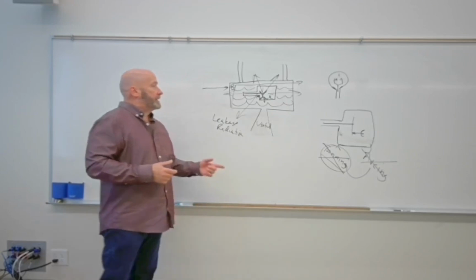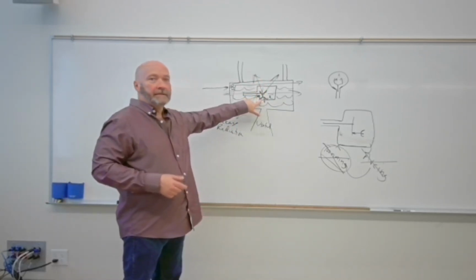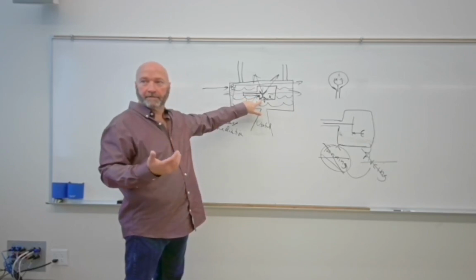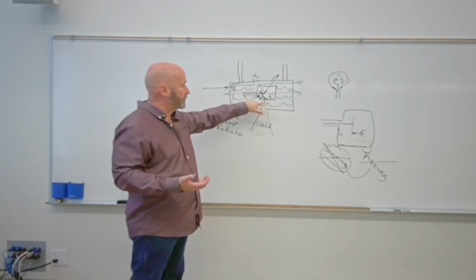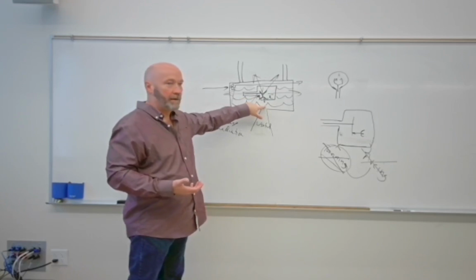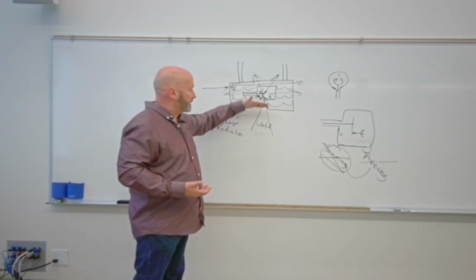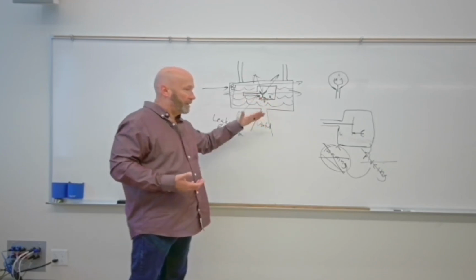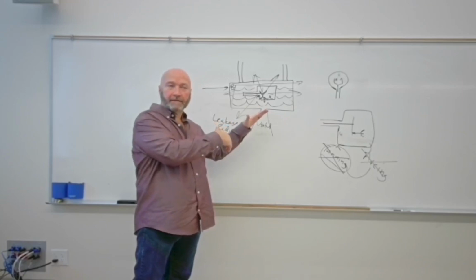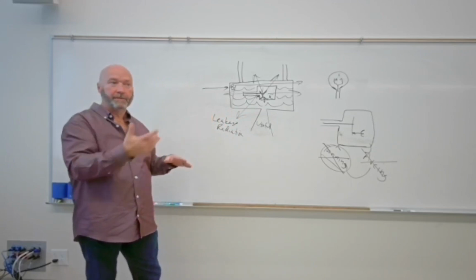What that means is that as the X-ray beam goes through the glass, remembering that nothing is radiolucent enough to absorb nothing, it's going to absorb some of those low energy X-ray photons. It's going to absorb some here in the oil. It's going to absorb some in this glass. It's going to absorb some, remembering that we've got a mirror inside of the collimator housing. The backside of that mirror is probably going to be silver, and it's going to absorb some.